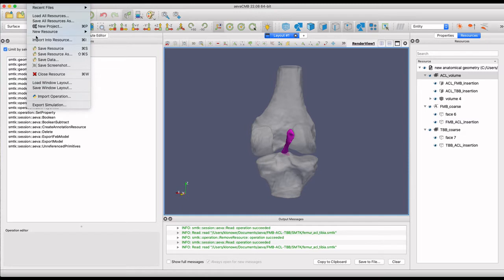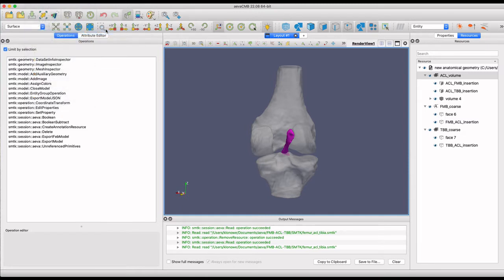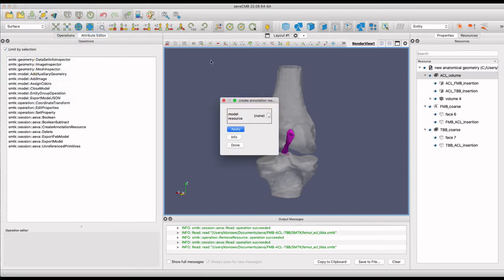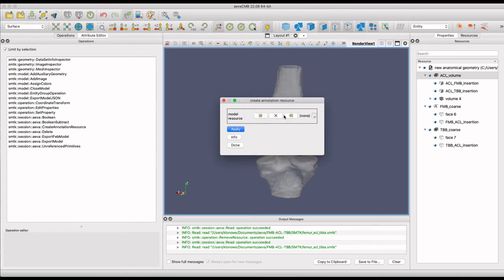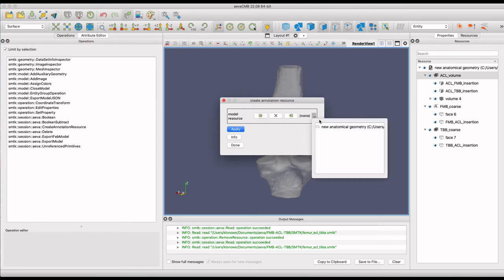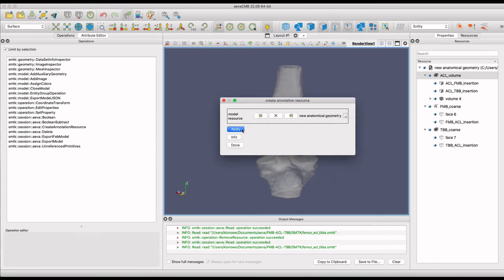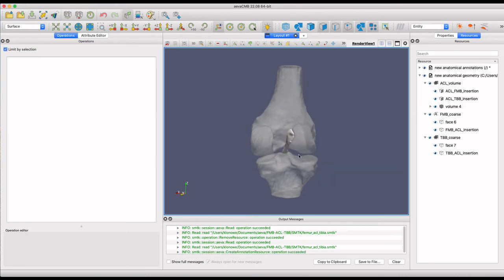The window that appears will associate a model resource to the new annotation. Choose the existing anatomical resource that contains the femur, tibia, and ACL model.